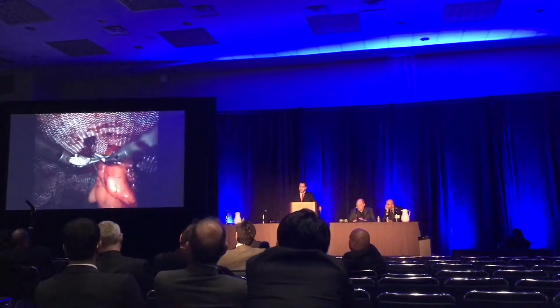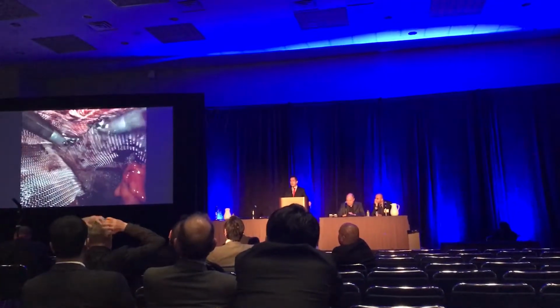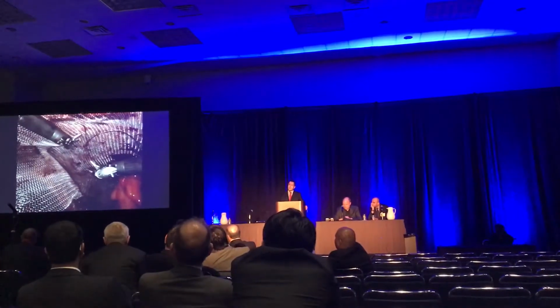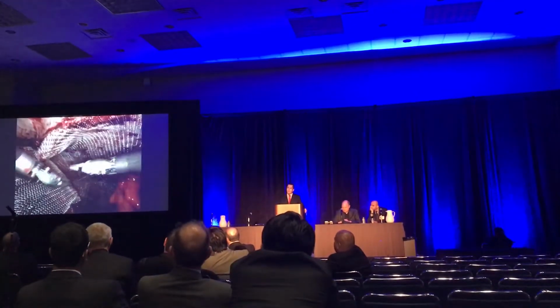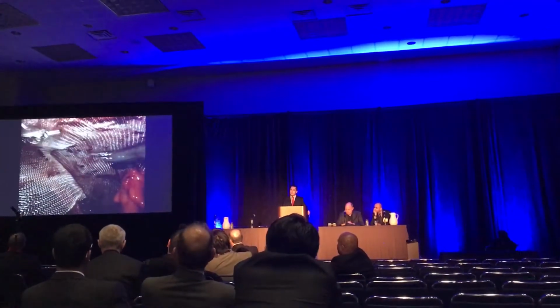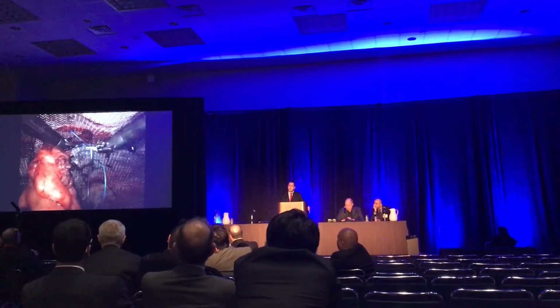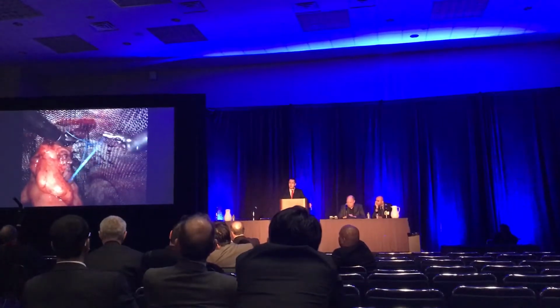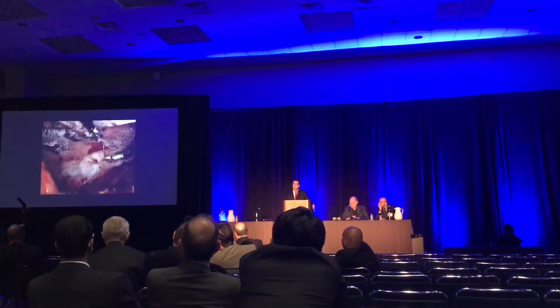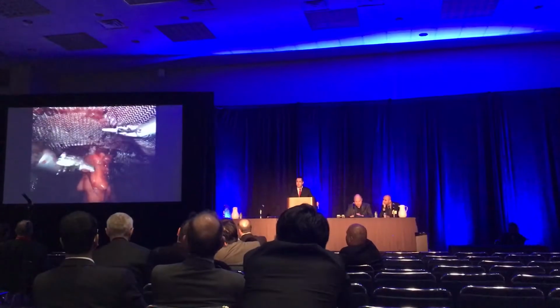The next step is vital to prevent recurrences. You'll see it in a minute. Here it is. The two leaflets of the keyhole that we created on the mesh are closed with a non-absorbable suture in a running fashion, but making sure you take a bite of the abdominal wall as well.